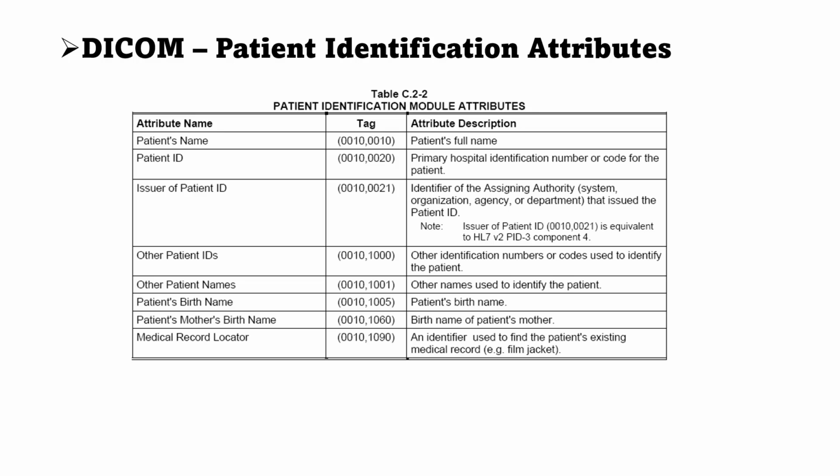Let's take a moment to look at the patient identification attributes. Notice we're looking at the patient ID, and in the patient ID we have different tags.